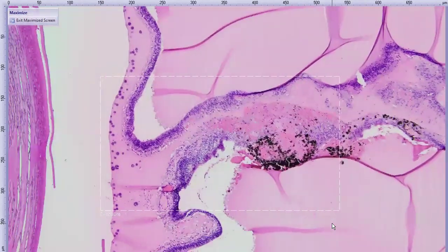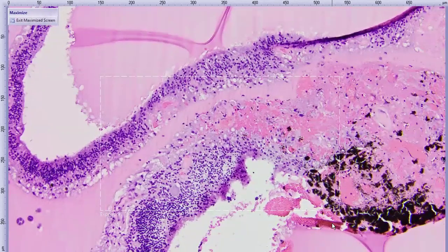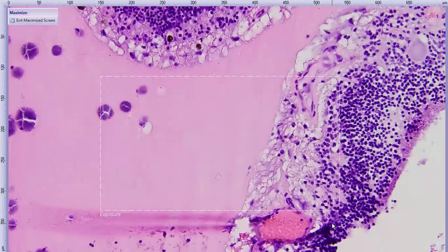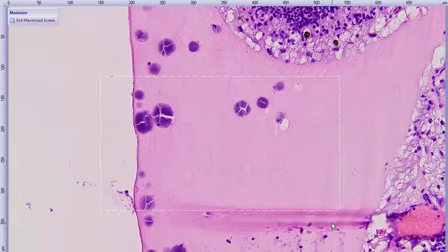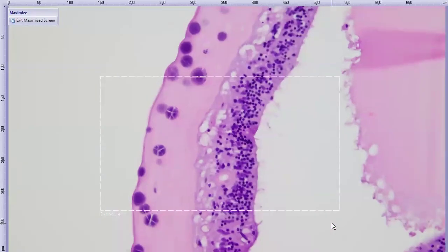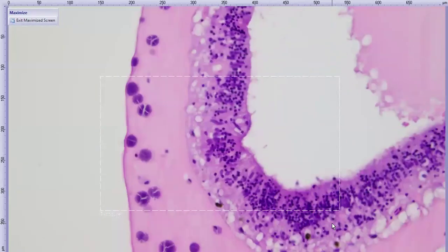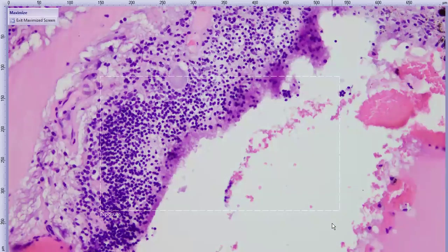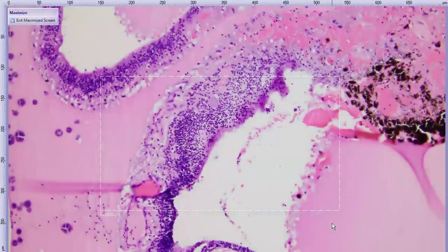So let's take a quick look at the retina. So the retina doesn't look super healthy either. Oh, this is also cute. I forgot about that. There is some asteroid hyalosis, some asteroid bodies. The asteroid bodies in this case are embedded in that super dense exudate. They're a little more basophilic than we often see, but that's what they are right there. So let's just follow the detached retina.